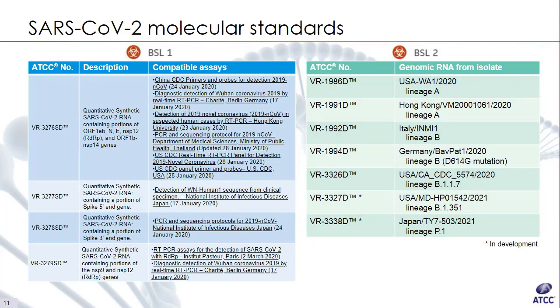The first isolate to the catalog was the reference strain for North America, Washington 1, 2020, first in genomic and then in heat inactivated format. We tried to diversify based on geographical isolation at first, and now that the phylogeny has been formalized, we're working on sourcing the CDC variants of concern and variants of interest. No variants of high consequence have been identified yet, but we would prioritize any of those that are designated as such. In addition, we're trying to source these lineages in the United States because CDC permits are now required for shipment of internationally sourced materials.